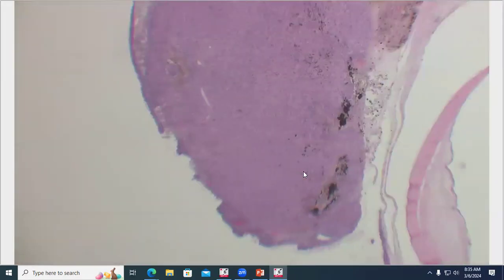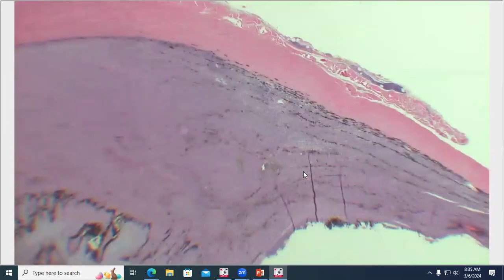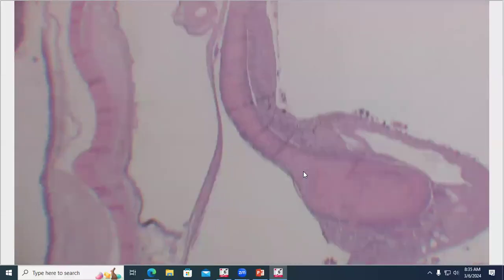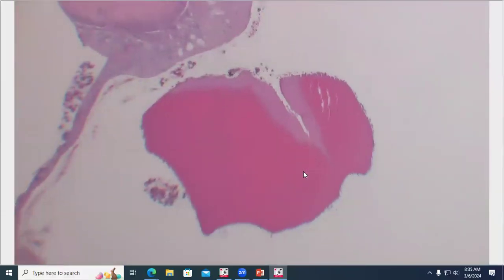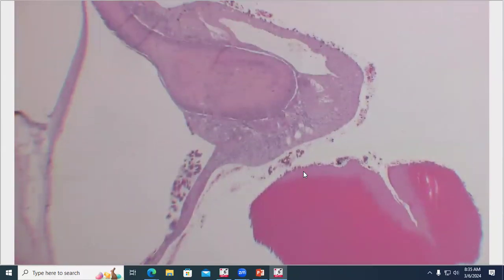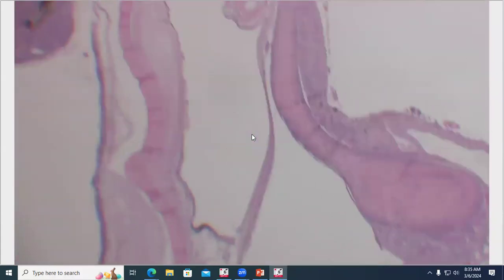I'll go back to that in just a second. Just want to show you the rest of the iris here. It's very hypercellular as well. So there really weren't many lens fibers. I think there's some free ones back here, like the nucleus out here in the subretinal space, because believe it or not, this is retina that is detached here. We've got more of a cellular infiltrate on top of that.